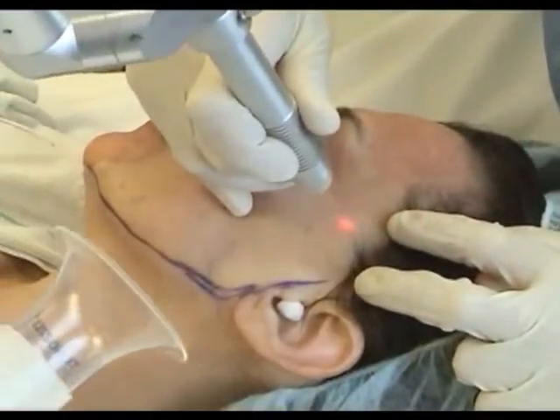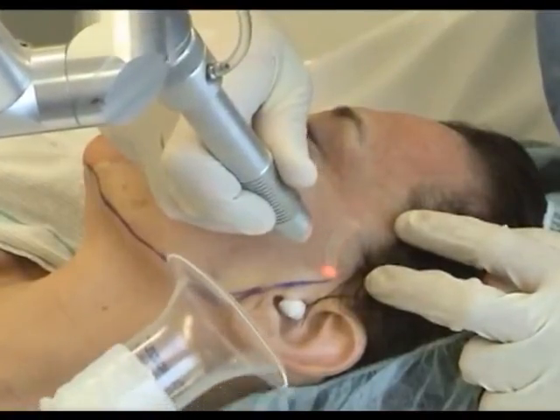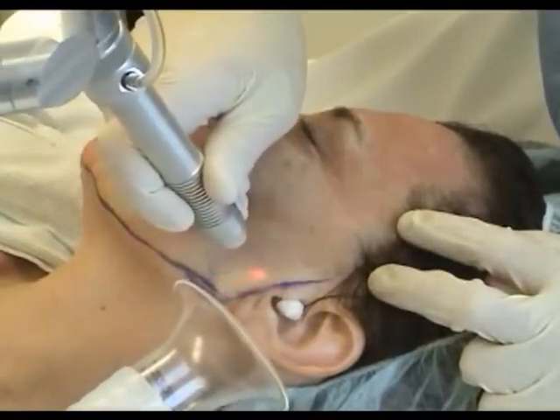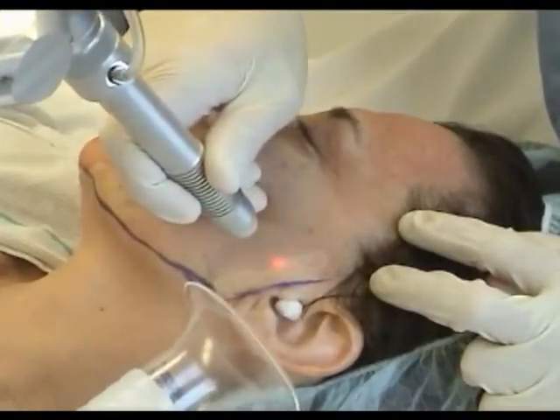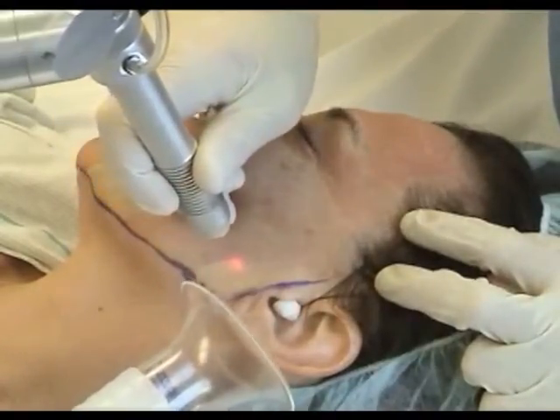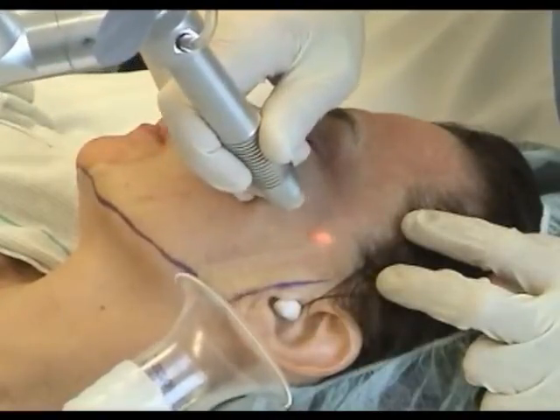There are many techniques used to resurface the skin. I personally prefer making the first pass with an erbium YAG laser, followed by a pass with the CO2 laser, and then finished with an additional pass of the erbium YAG laser. Here I'm using 5mm spot size with a fluence of 12 joules per centimeter squared. At this fluence with a slight overlap, the epidermis may be almost completely removed with a single pass.